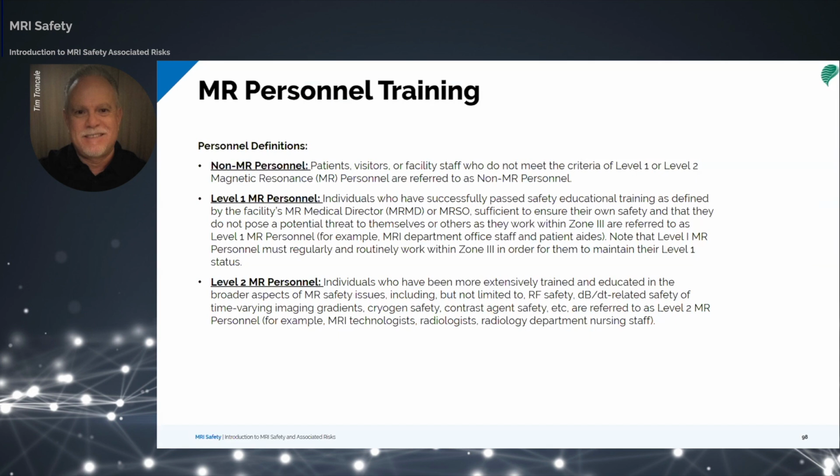Let's look at the 3 levels of MR department and healthcare personnel as described by the ACR. The first level is non-MR personnel. Patients, visitors, facility staff who do not meet the criteria of level 1 or level 2 magnetic resonance personnel are referred to as non-MR personnel.